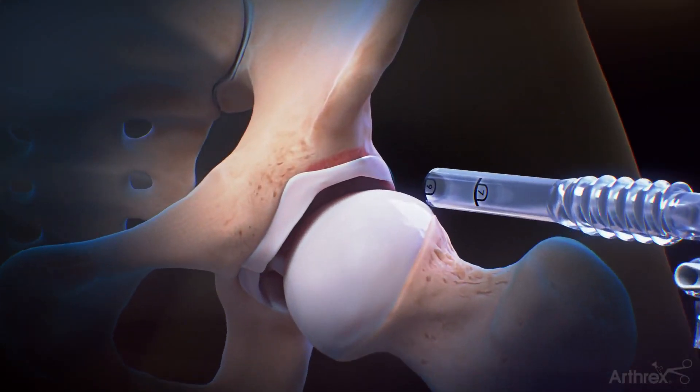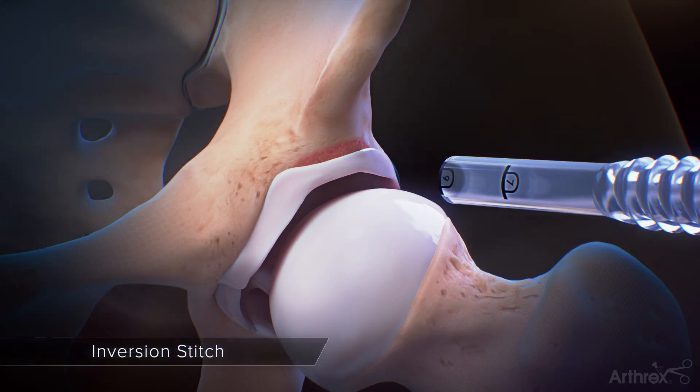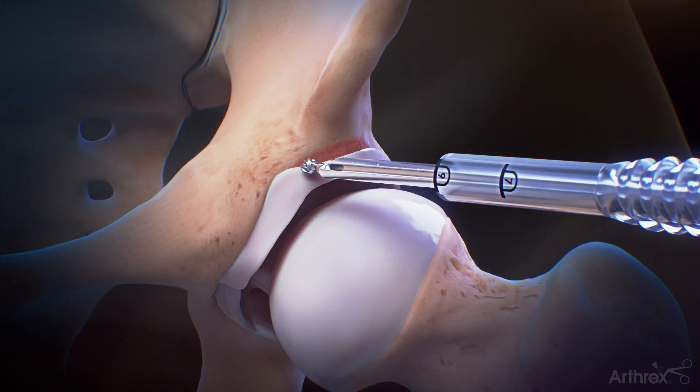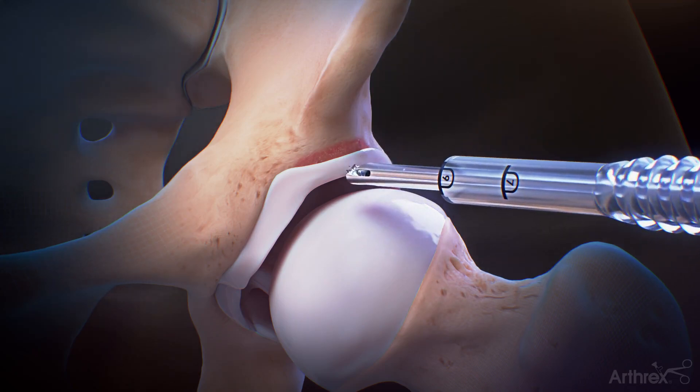Hip labral repair with 2.4 mm knotless hip suture tack anchors and swift stitch suture passer inversion stitch. Insert a 4.0 mm round retractable hood burr through a Tremec custom hip cannula and perform an acetabuloplasty.